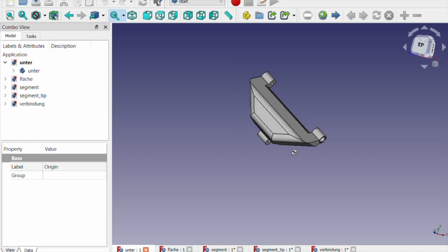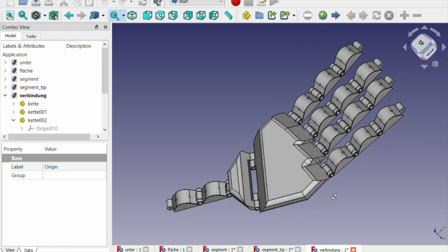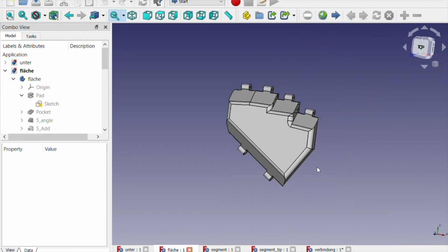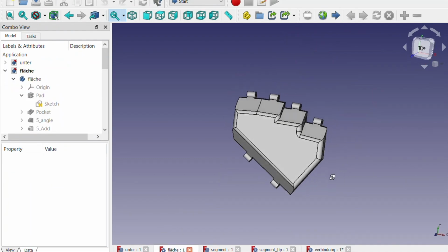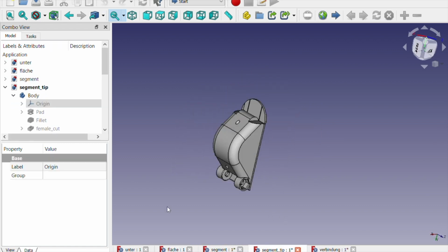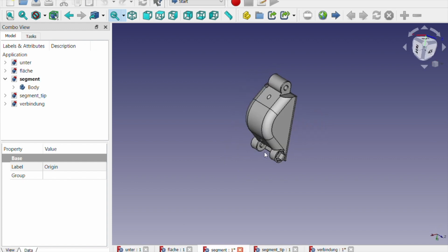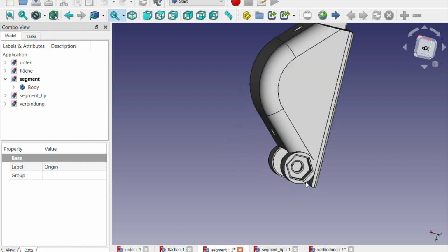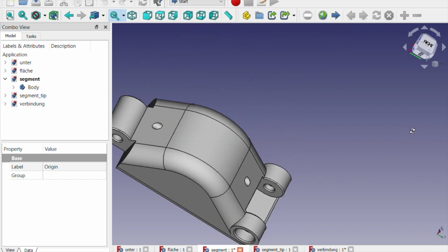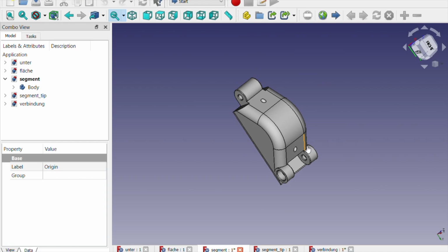We'll start by modeling the parts with some free CAD software. The hand will consist of a palm, 4 fingers, and a thumb. The palm is a solid object with joints for the fingers to attach to. The fingers will consist of 3 segments, all identical except for the tip, which will have a fingernail. The thumb will consist of 2 of these segments plus 1 unique segment. Using identical segments for most of these parts keeps the hand modular and allows for easy replacement. The hand is also designed to fit together with standard M2 nuts and bolts, which are also easy to replace.